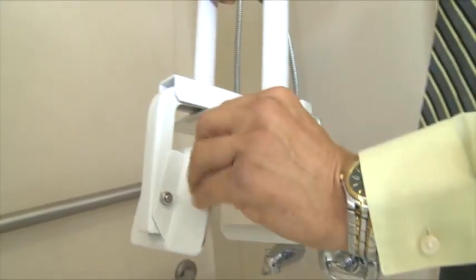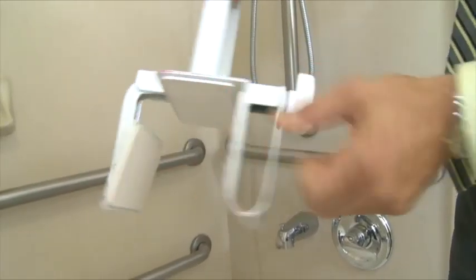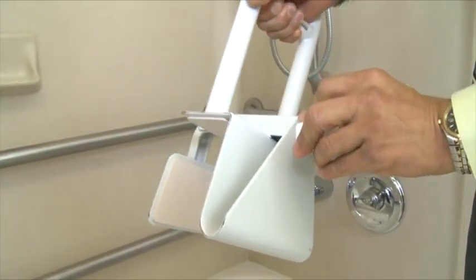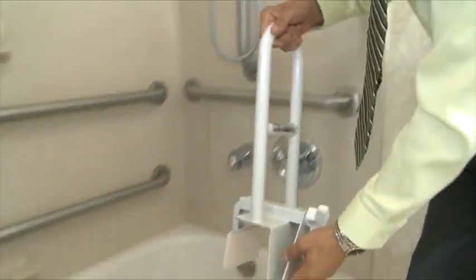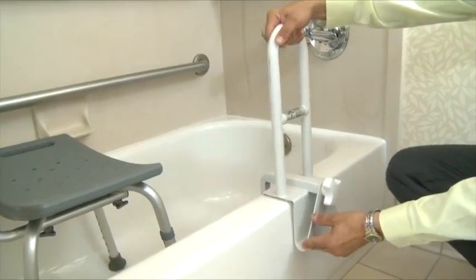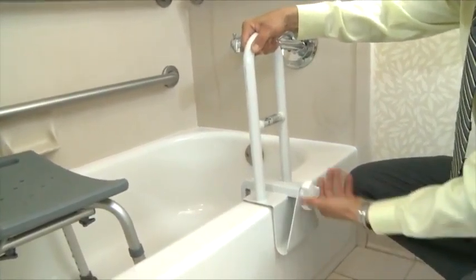To set up the tub bar, inspect the height adjustment buttons and the clamp mechanism for stability and proper functioning. Attach the tub bar to the side of the tub per the manufacturer's instructions.